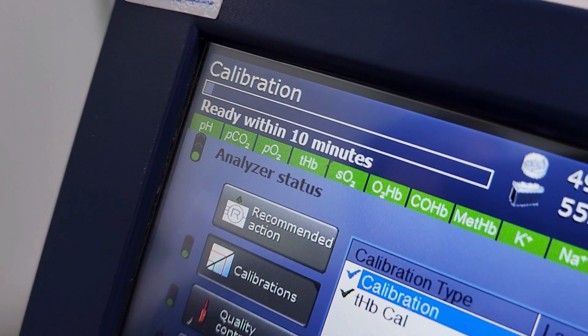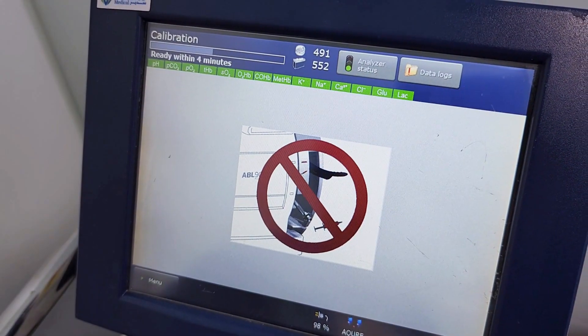Calibrations are performed automatically in accordance with the calibration schedule every two hours.